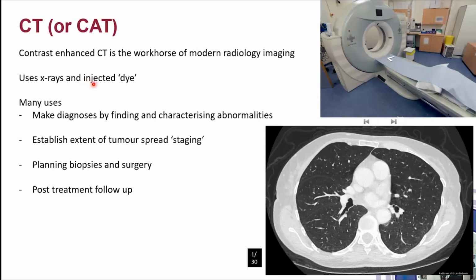They usually also use an injected, what we call a dye or a contrast agent, and that makes the pictures a little bit less grey, gives them a bit more contrast.